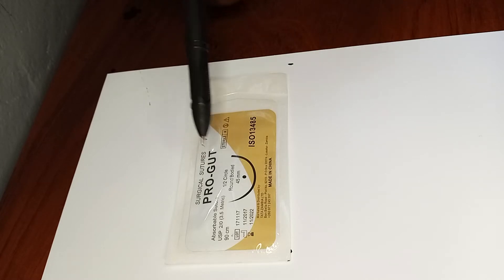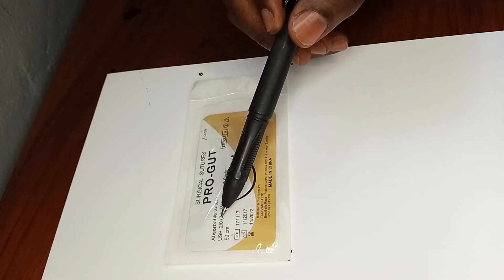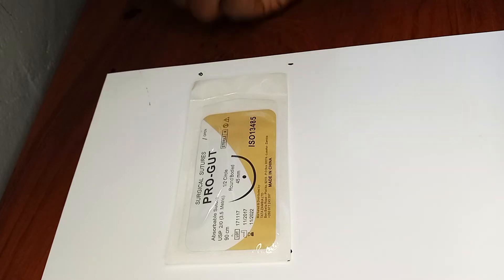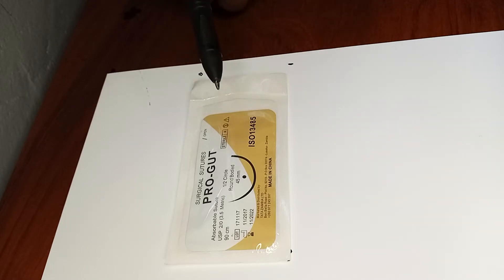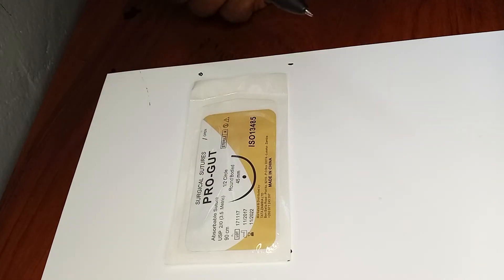We can see there's a 'two zero' there — this is how the thickness of the thread is written. Sutures can be size one, two, or zero, but they can also be two zero, three zero, four zero, or five zero. Two zero is bigger than three zero, three zero is bigger than four zero, and four zero is bigger than five zero. However, number one is bigger than number zero, and number two is bigger than number one.